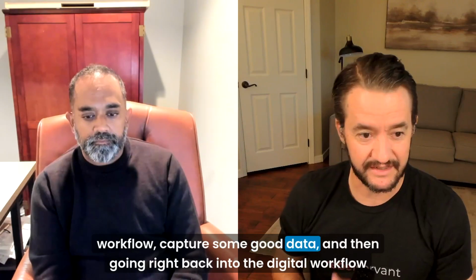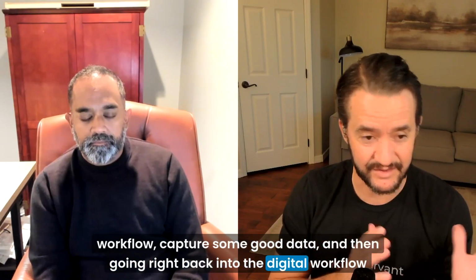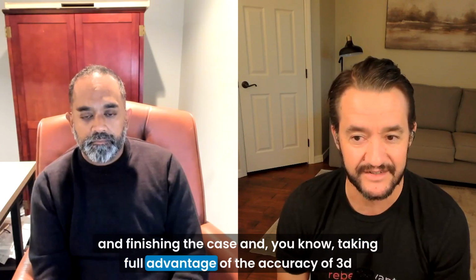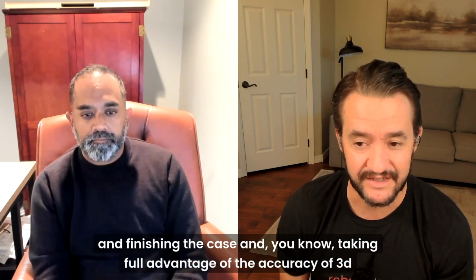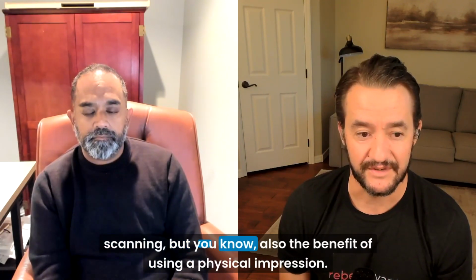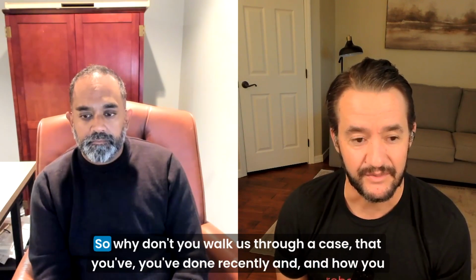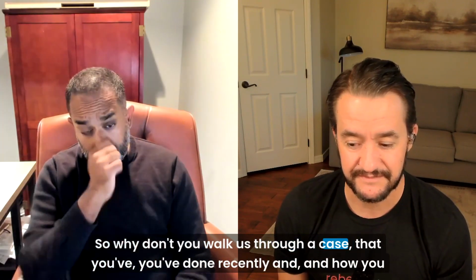Yeah, it's that idea of using an analog tool to step out of a digital workflow, capture some good data, and then going right back into the digital workflow and finishing the case, and taking full advantage of the accuracy of 3D scanning, but also the benefit of using a physical impression. So why don't you walk us through a case?